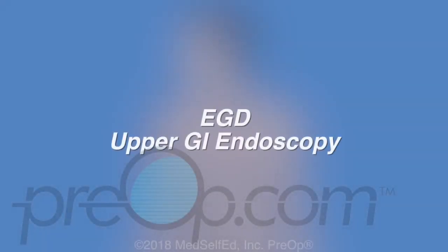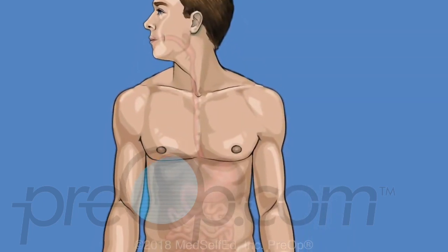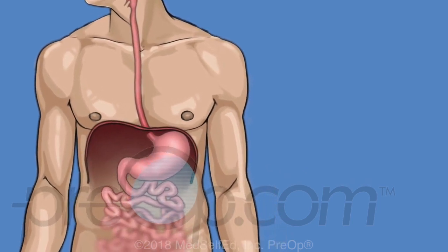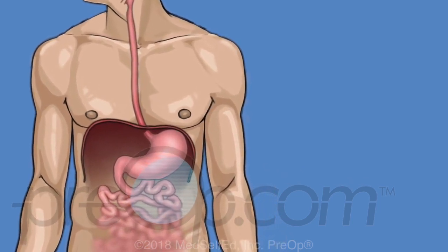Your doctor has recommended that you have an EGD, also known as an upper GI endoscopy. This video will help you to understand this minimally invasive procedure. Let's begin by reviewing information about your body.